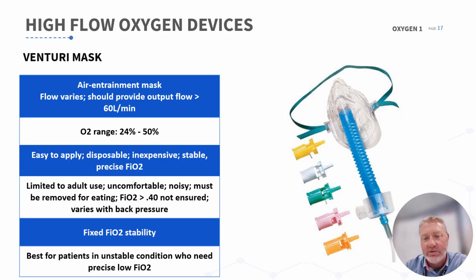Instead, there's an equation that we use based on the air-oxygen ratio to determine the device's total flow. Now, I don't think that's anything that you'll ever need to do in the field, but it's super important to understand: if you ever use a Venturi mask, always, always, always go by what information is on the adapter.